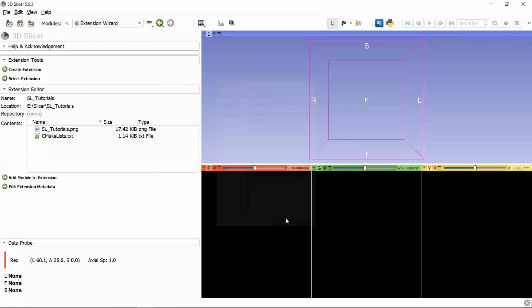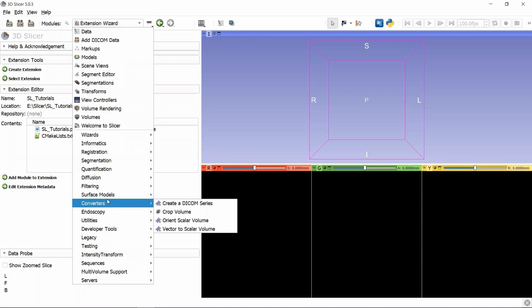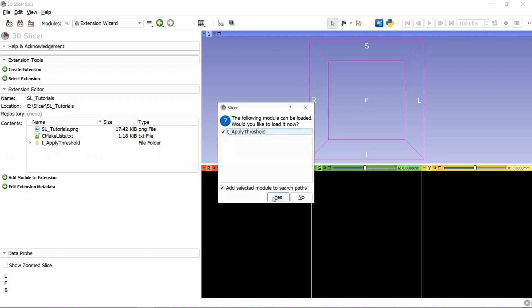Click OK. In one extension, you can add multiple modules, just like all those examples. There are multiple modules in one extension. Now let's add one module to the extension. Give the module name, T for template, apply, threshold, and click OK. Click Yes.